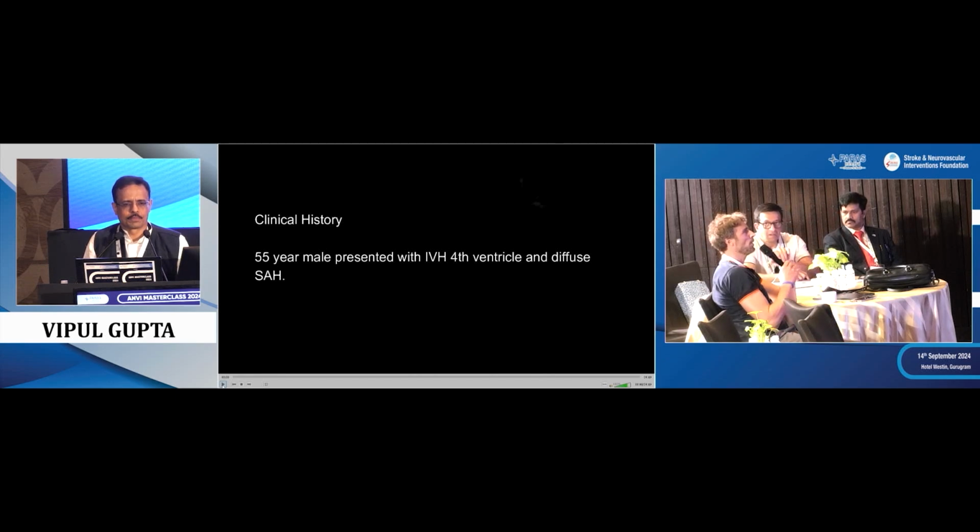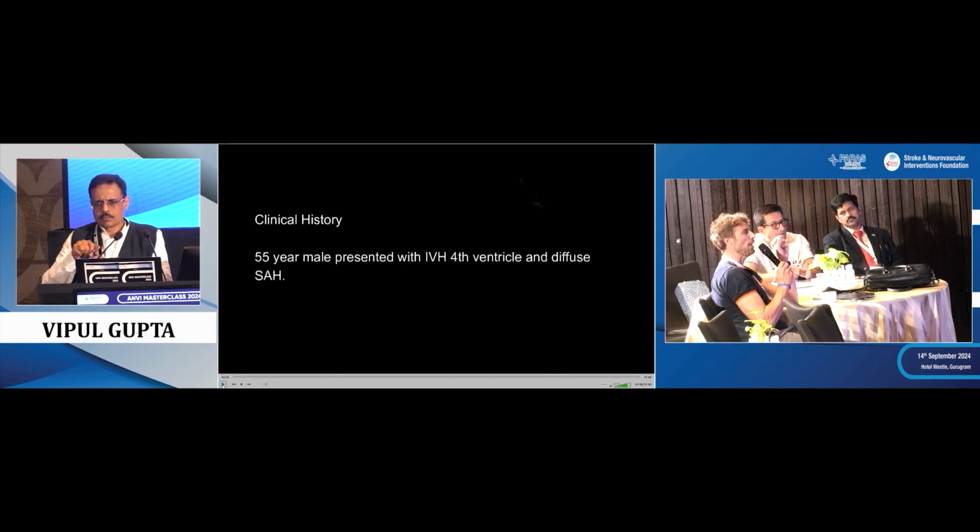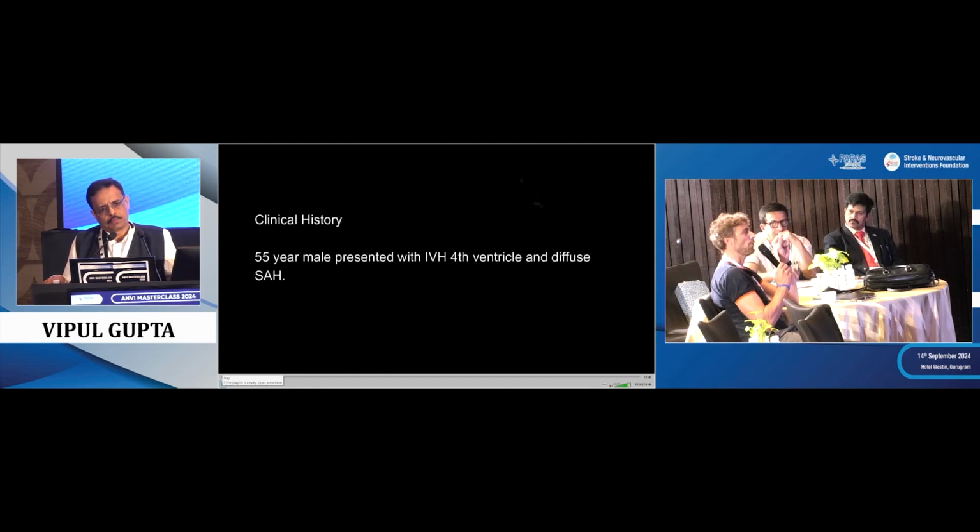There's just one point, because we don't see the disease and we are only looking at the luminogram, the trap could be to underestimate the length of the disease, meaning that you want to stent and cover with the flow diverter, and you are too short. So when you are doing it with the flow diverter, it's very important to cover very largely from the M1 to the carotid, because we saw a case where we thought it was cured, but the dissection just progressed distally to the lesion. Because we're working on luminogram today and not with an intravascular understanding of the whole disease, it's very important to be sure that you're covering the entire disease.